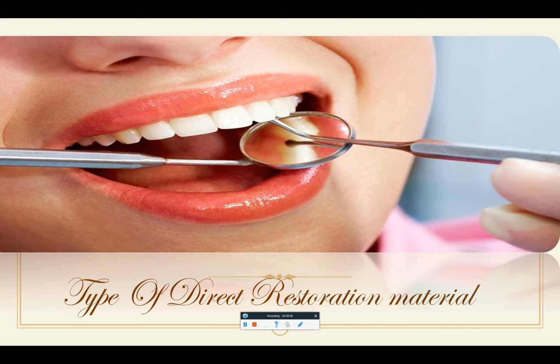This is a type of filling that we can always use as a temporary filling after RCT, or we can use this GIC as a cement for a crown or bridge, or also for pulp capping or pulpectomy for pedo, or pediatric. Okay, GIC stands for glass ionomer cement.